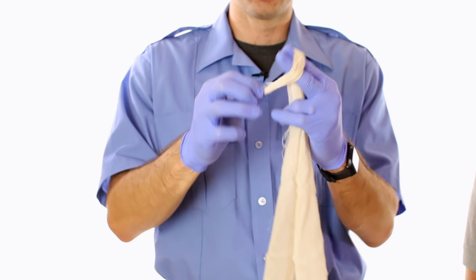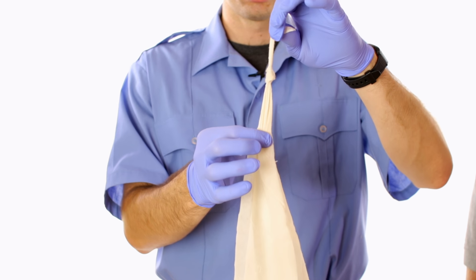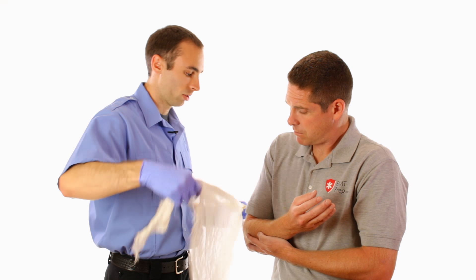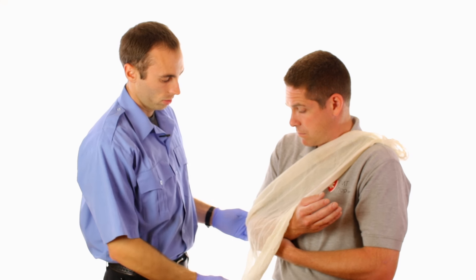Tie an overhand knot to create a cradle for the elbow to rest in. Take the sling with the triangle pointed toward the elbow and gently place over the patient.